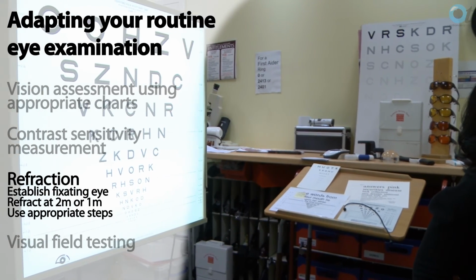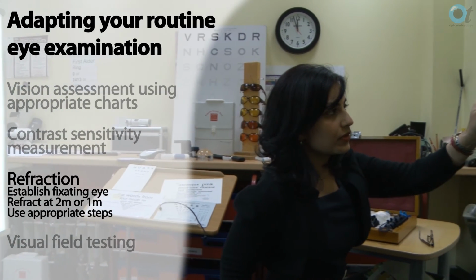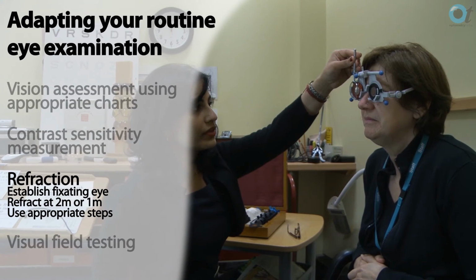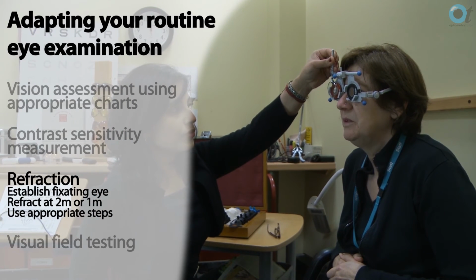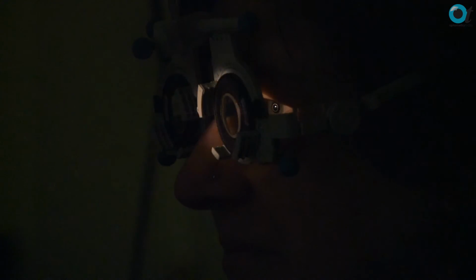Refraction should always be performed as part of a low vision assessment, but the subjective routine may need to be modified. Using a ±1 cross-cylinder is often really useful, as is using larger steps when we check the spherical correction. It is important that we don't dwell on tasks that the person isn't able to do.